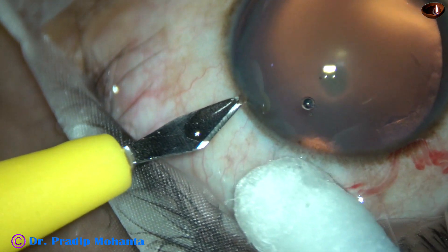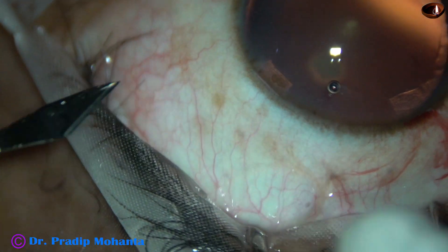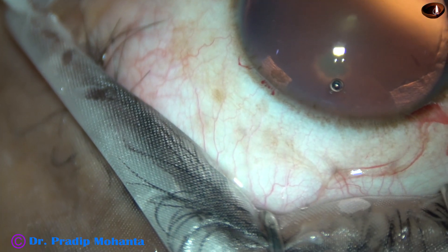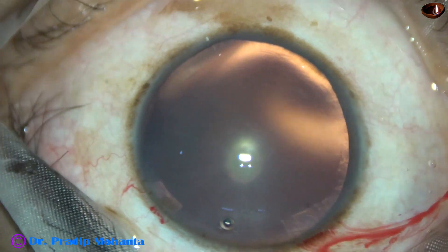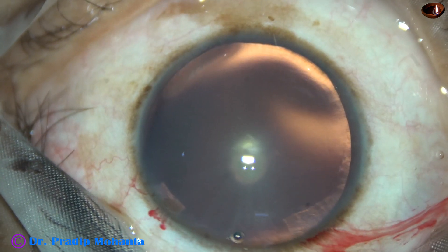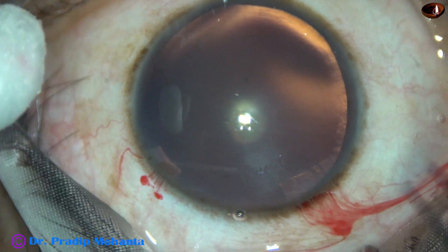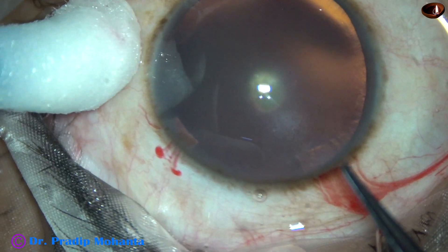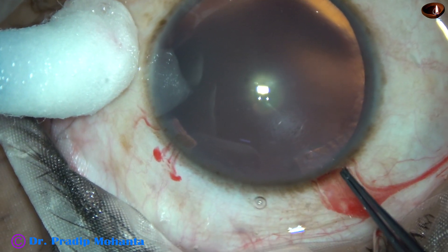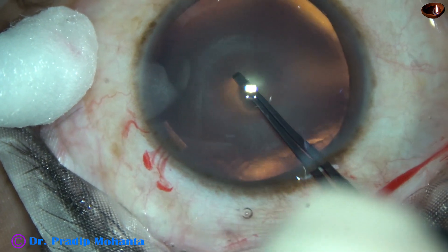Being inspired by his videos and his ideas, in this case I have planned to do hydrodissection. By this time the main incision and a side port has been made on the left side of the main incision, and now hydrodissection is being done.